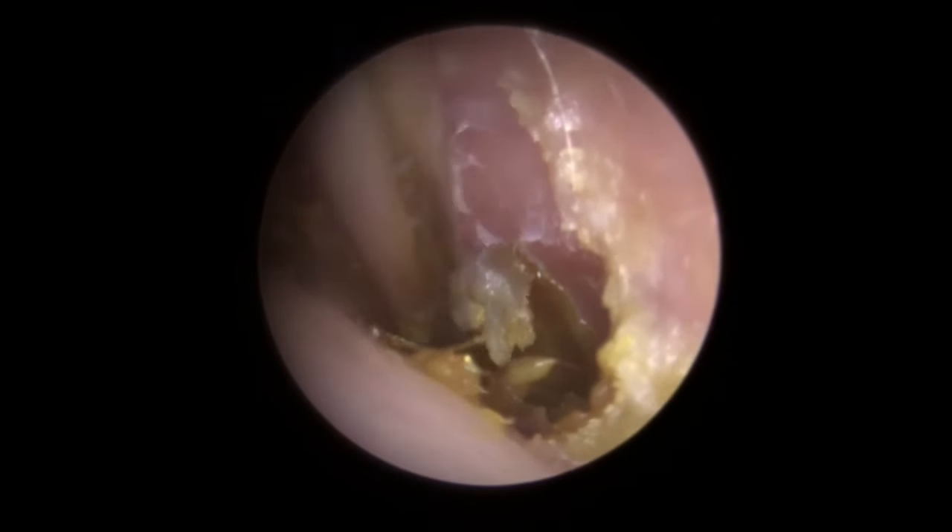So I'm just trying to break down this front section — really trying to hold on to get a good grip there. You can see the patient just moving around quite a bit, so I'm trying to stay as steady as I can. Now what you've got to remember, when you've got a long piece of wax like this — sometimes you can feel a little bit more uncomfortable because of the bends in ear canals. If you've got a piece of wax that's formed onto those bends, when you're trying to manoeuvre it out, you're trying to take it out of its natural position, which can sometimes be a little bit uncomfortable for the patient.